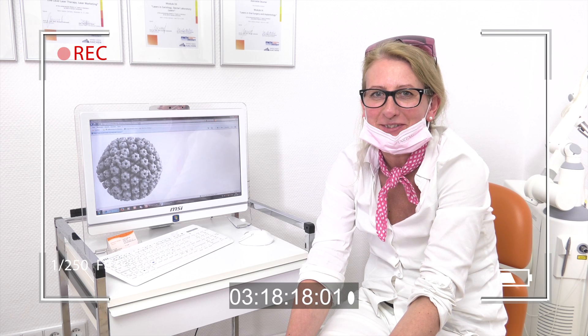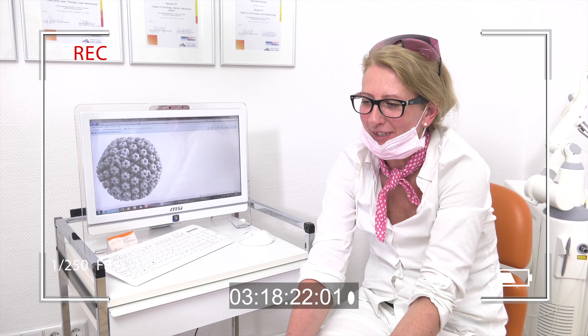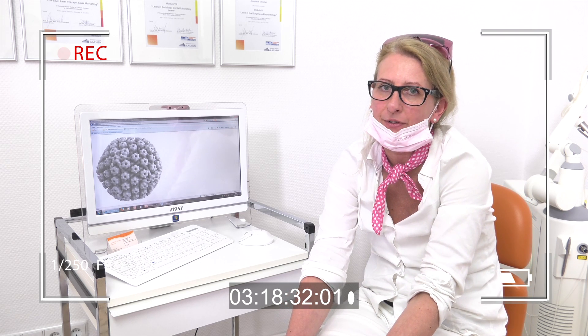Next time we will show you the preparation on a tooth.